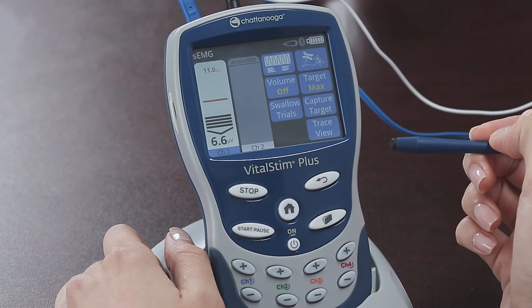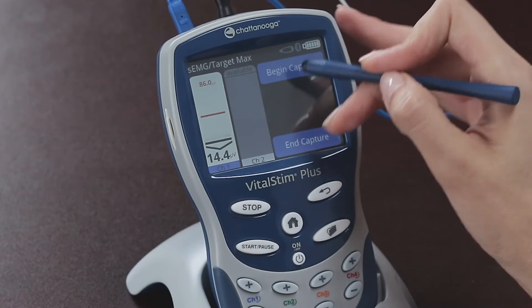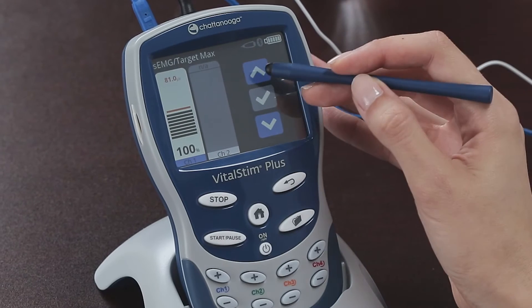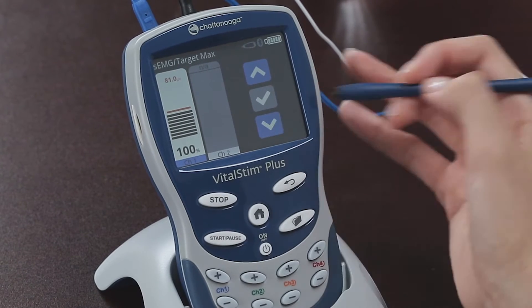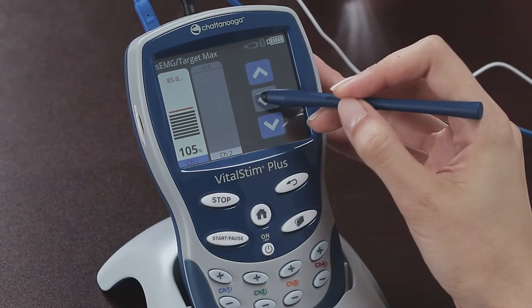Make sure the recording electrodes are connected to channel 1 and that channel 1 is highlighted on the screen. Also make sure that the reference electrode is connected somewhere nearby on the body. Press begin capture and ask the patient to perform a couple of contractions. Press end capture when you are satisfied with the effort. On the screen that now appears, you have the opportunity to adjust the captured level further — increase or decrease it depending on whether you want to make it more or less challenging for the patient.